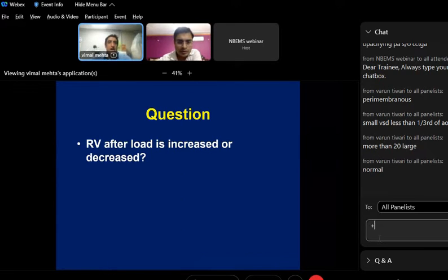Now tell me, is RV afterload increased or decreased?